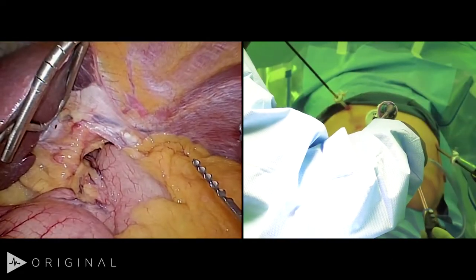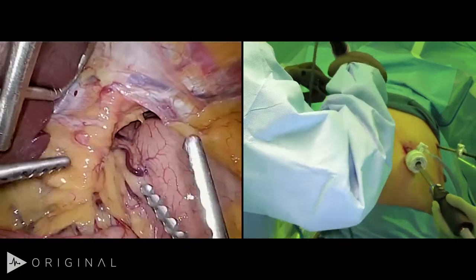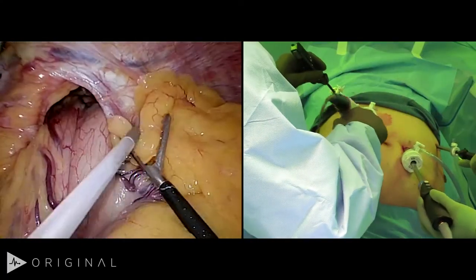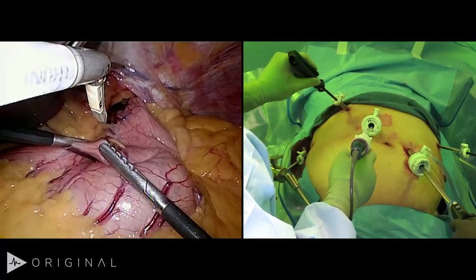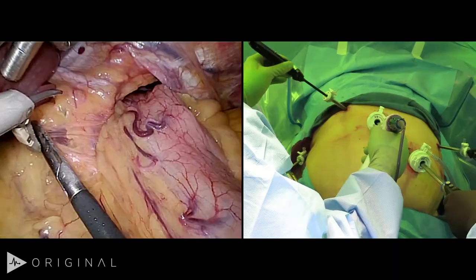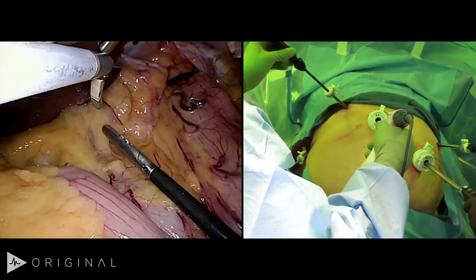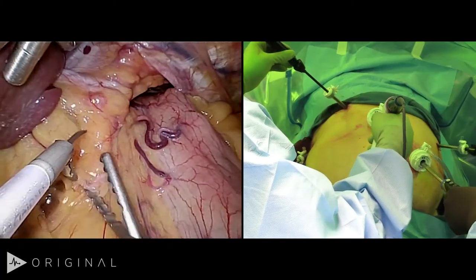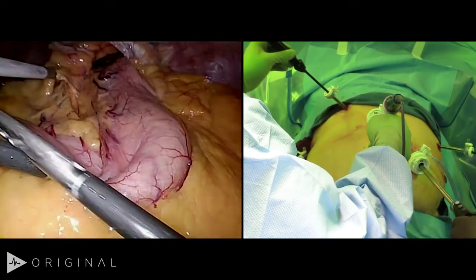We're going to start by working on the hernia sac — we'll just circumferentially mobilize it. That's a big hernia. We normally begin by taking down the hepatogastric ligament, which is right here. You have to be careful here — this is the right gastric artery right there, so you've got to be careful about that. Let's go through this space that you can see right through.